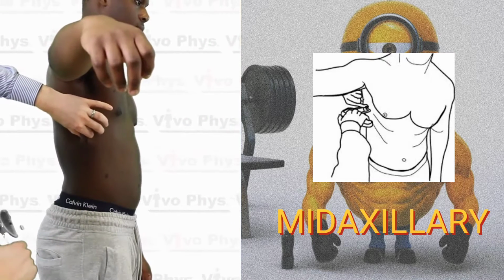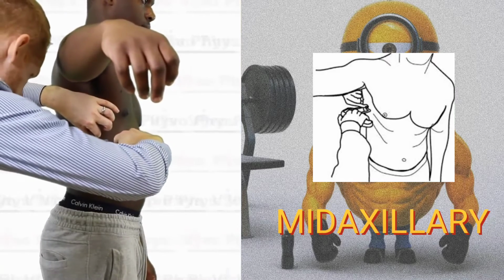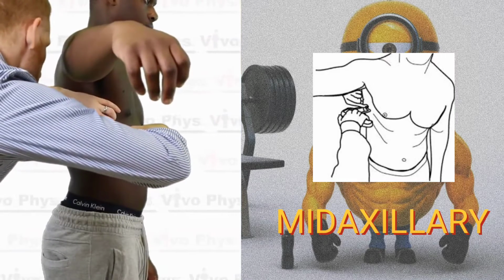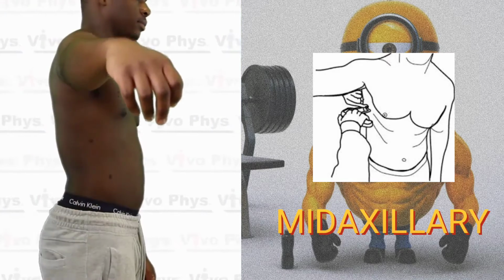Typically on a female, this is going to be right underneath where the sports bra strap is. So you just flip up the edge of the strap just a little bit so you can access the proper site to do the skinfold. And this is going to be a vertical skinfold site.